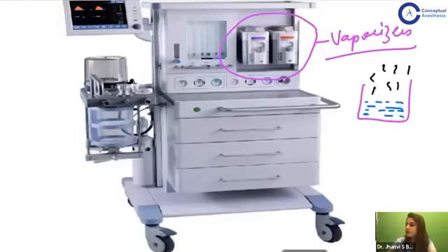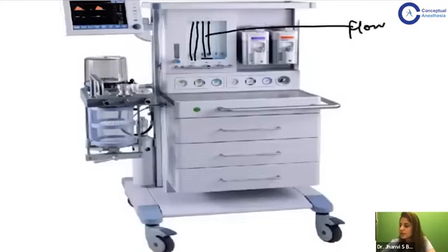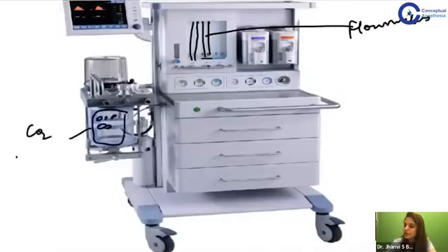Now you will say, ma'am, what is the question that will be asked in the exam? The question that will be asked in the exam is to identify what is the inhaled anesthetic agent in the vaporizer. We will discuss that ahead when we discuss inhalational agents. The next thing you need to identify in the machine is these glass tubes over here. These glass tubes are nothing but flow meters. And one more thing you need to identify here, you will have a dabba of carbon dioxide absorber.